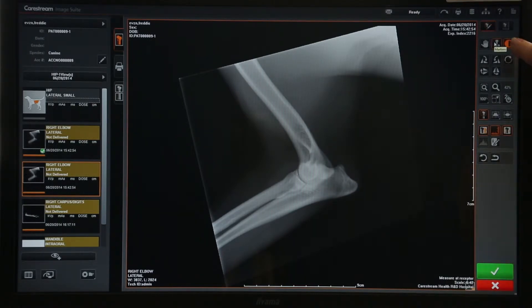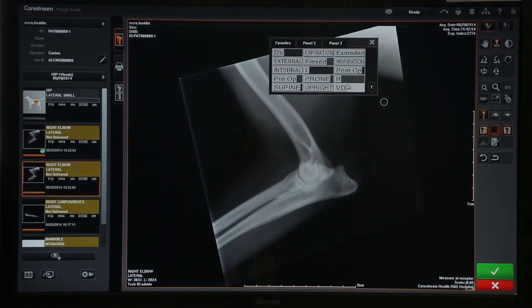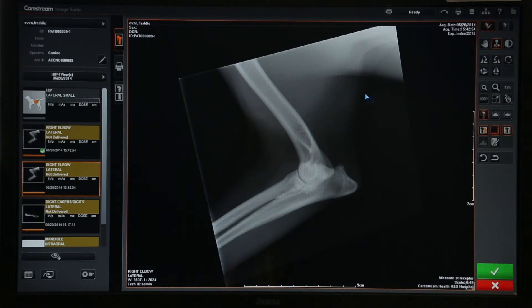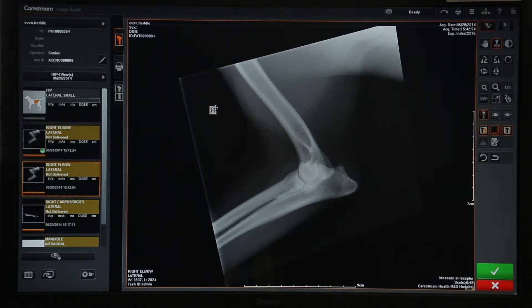Your next icon is markers, and by clicking onto markers this enables you to enter text onto the screen. On this picture we've managed to collimate off our marker, so by tapping we can choose and pop a marker on, and you can move these around the screen to wherever you need them. You can also erase them, so if you put the wrong marker on it's very easy to remove it and replace it with the correct one.